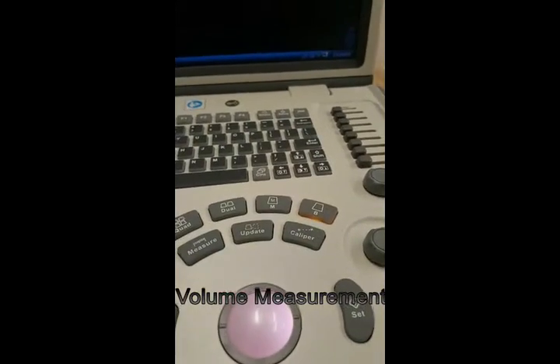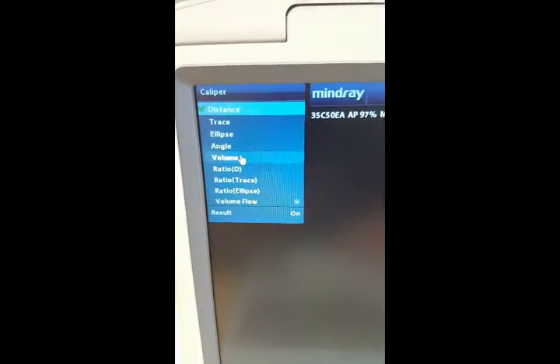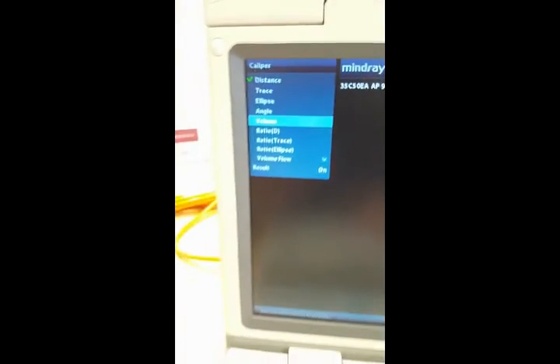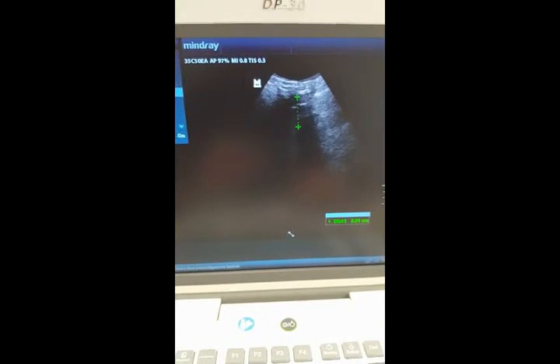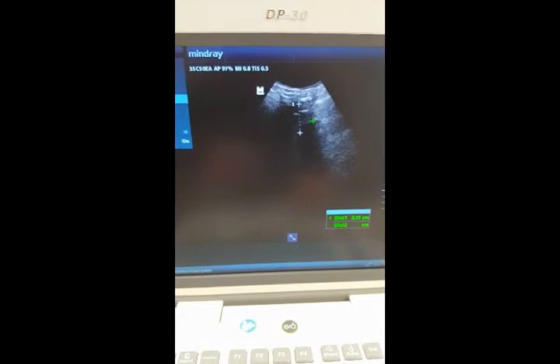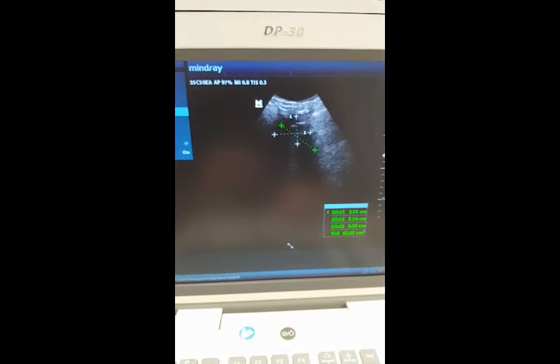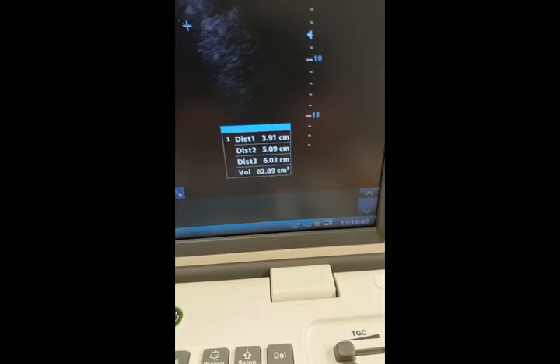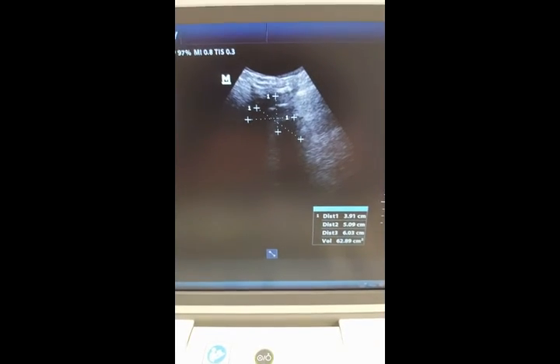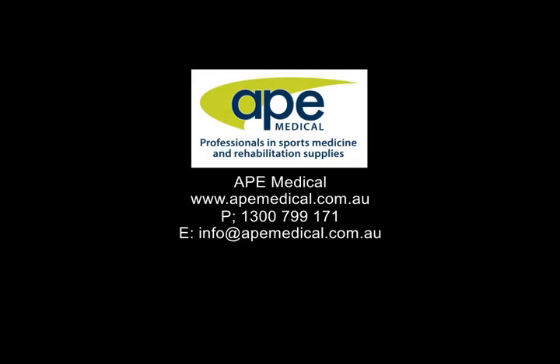To measure volumes, press the caliper button again, and that brings up this menu there. Go over and highlight the volume. You'll see it says measure distance one — use your trackball and set, so that will be your first distance. Then you need a second distance, and then a third distance, which will allow you to get your volume. The volume is then displayed down here in cubic centimeters. Obviously the way that you measure the volume is something that needs to be taught, and you need to know the specifics.